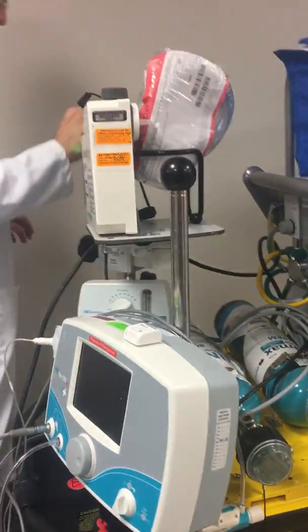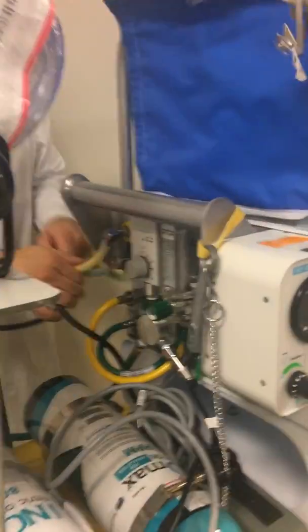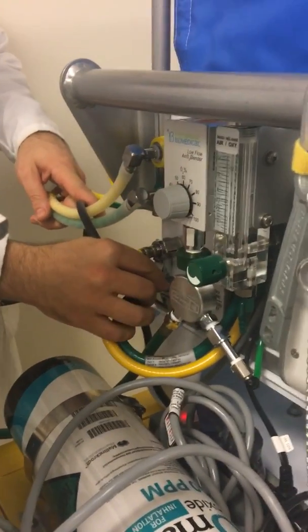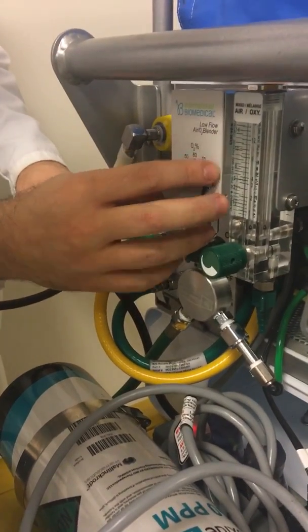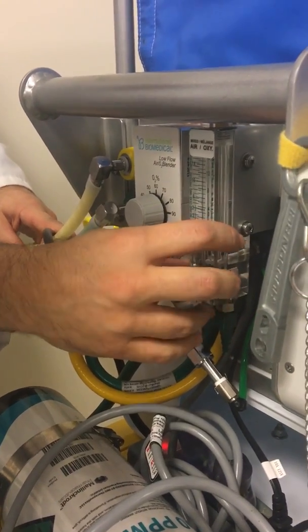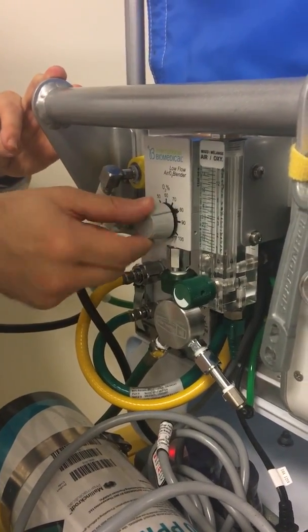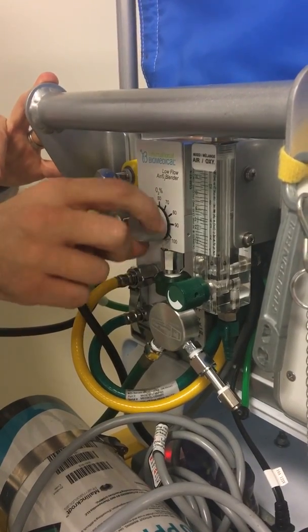In the back here, the curlies go in here and the straights go in here. They all connect to a blender and through this flow meter — everything is connected through the same source. So anytime you're doing FiO2 changes, no matter what you're doing, this is your blender. Very important.